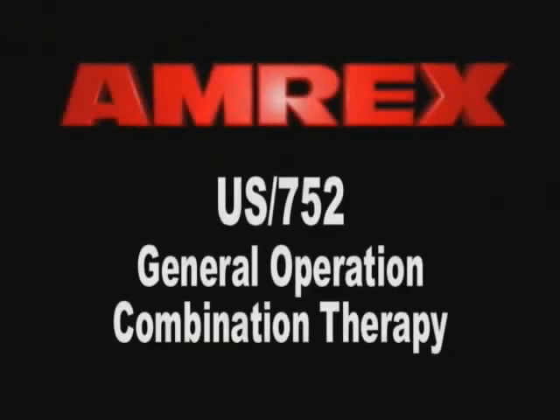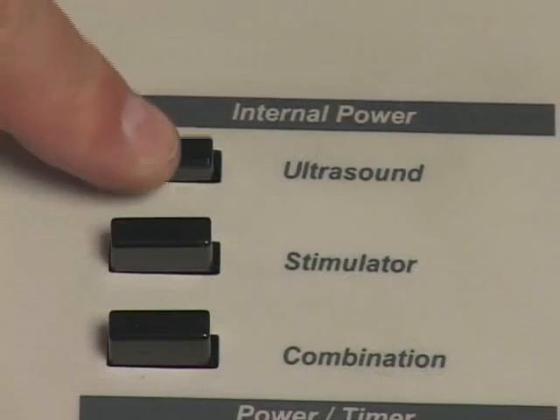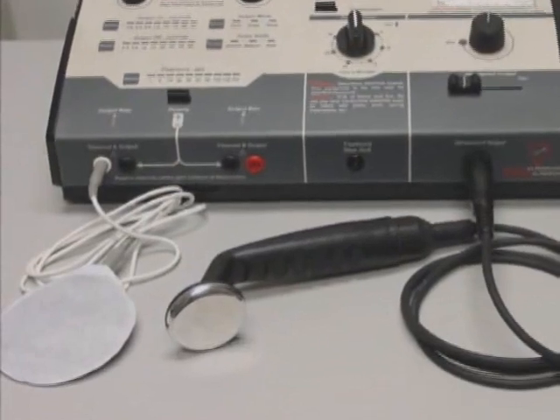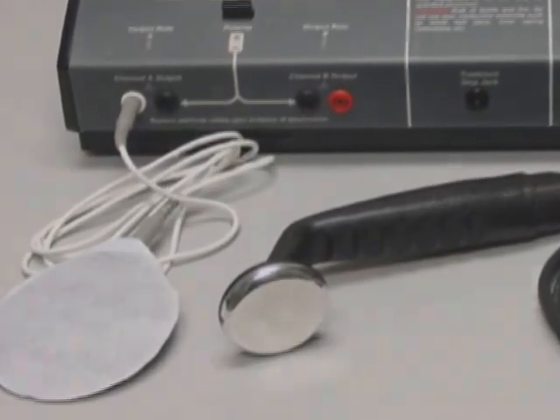U.S. 752 General Operation – Combination Therapy. Combination Therapy is the ultrasound and stimulator modality applied through the ultrasound transducer simultaneously. Depressing the U.S. 752 internal power ultrasound, stimulator, and combination switches to the on-down position, and properly connecting a dispersive pad to the white Channel A output jack will enable combination therapy.